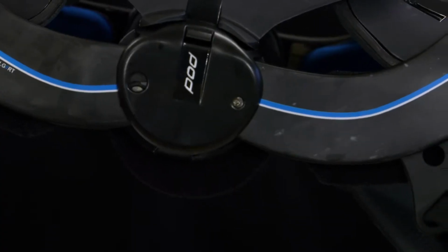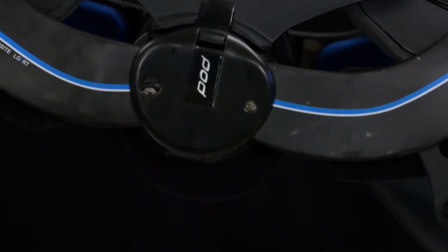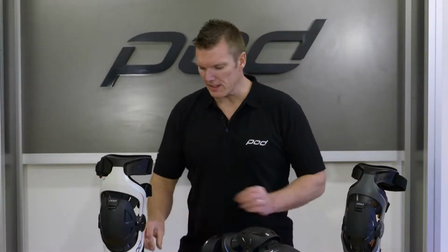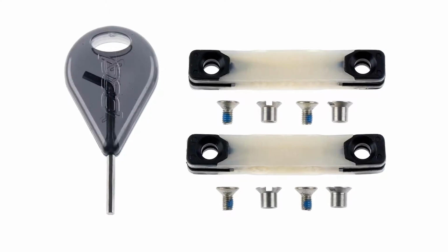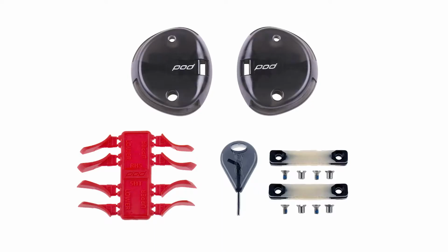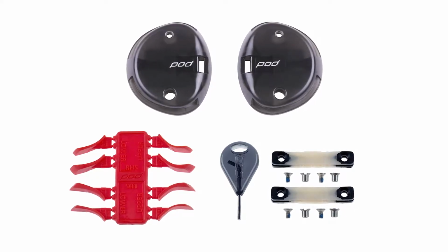So in checking your ligament, when you lock out the brace, you need to make sure the 2 screws are visible within those holes. If they aren't, that's when you need to replace the ligament. You can quite easily order the ligament kits, which is the 2 ligaments. It provides the screws as well as the tool to replace the screws, or a whole hinge housing kit, which has the hinge housing, the shim stops, as well as the ligaments within.